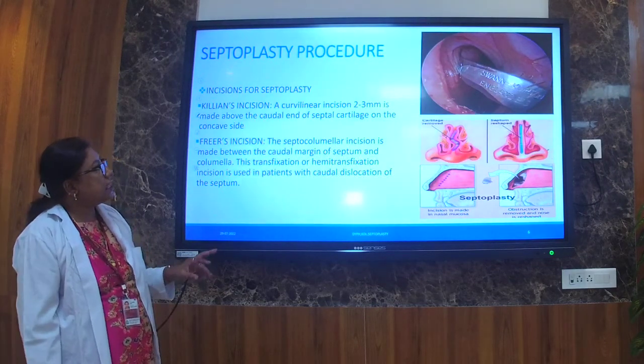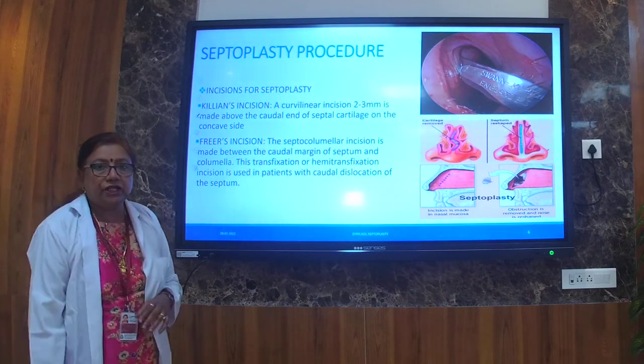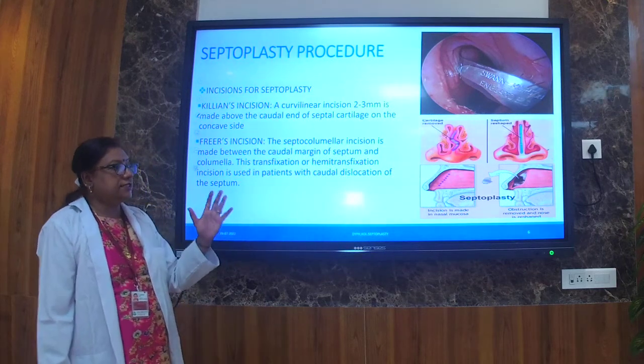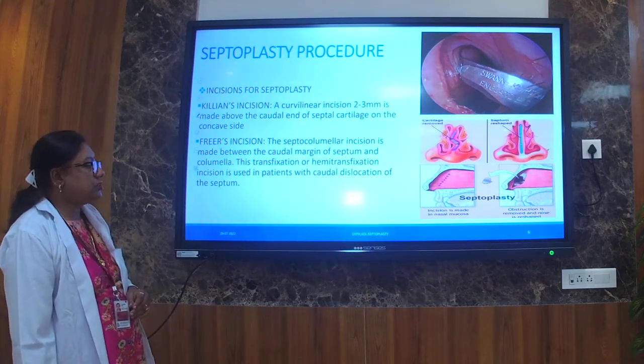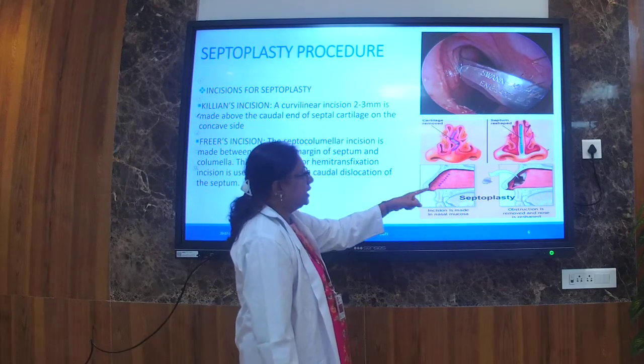Now we'll discuss the septoplasty procedure: how to take the incision, how you elevate the flap, all this we'll discuss now. If you see in this picture, this is where we take the incision.